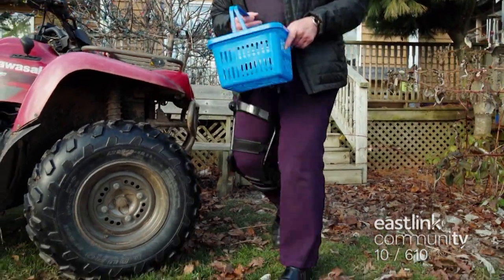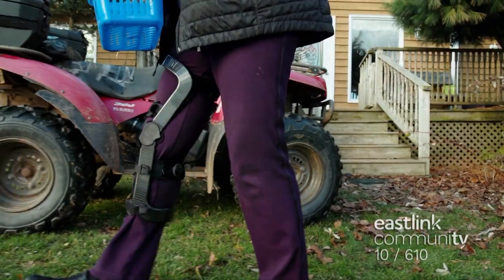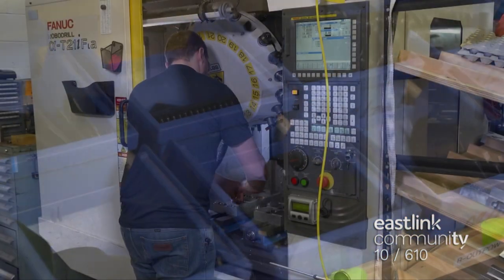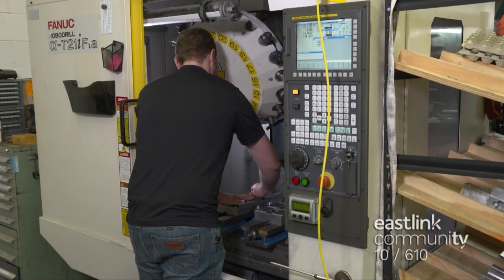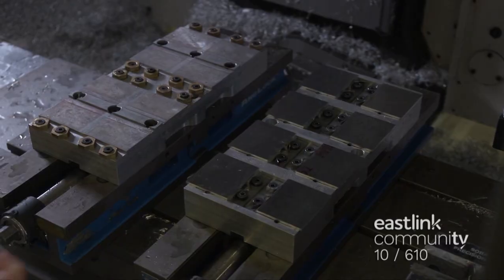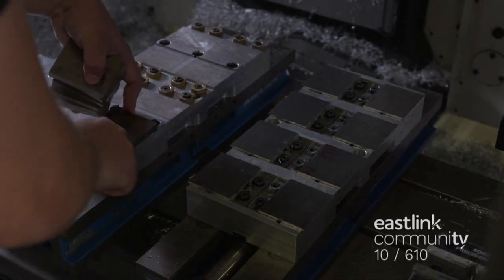The power hinge is where the patented spring technology is located. The hinge is made up of many parts, most of which are made on site. This vertical milling machine center is making the power hinge caps out of 7075 aluminum blanks. This hard aluminum has the same strength as steel, but it's much lighter.